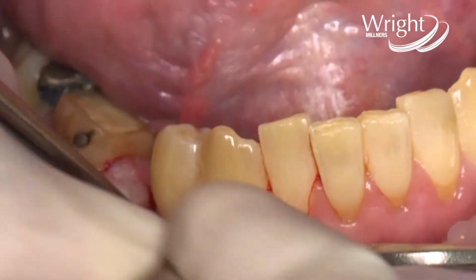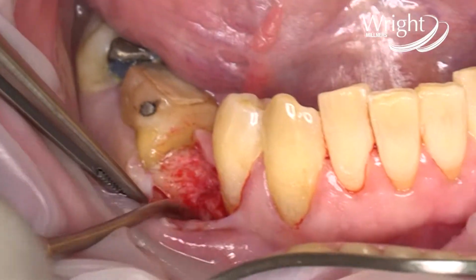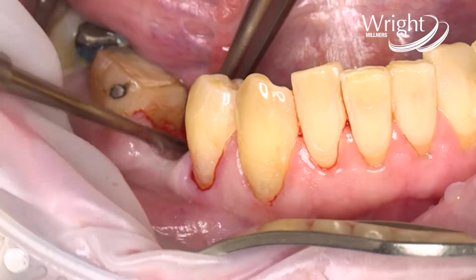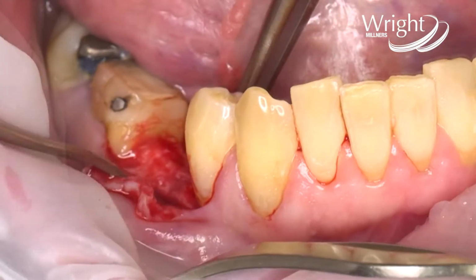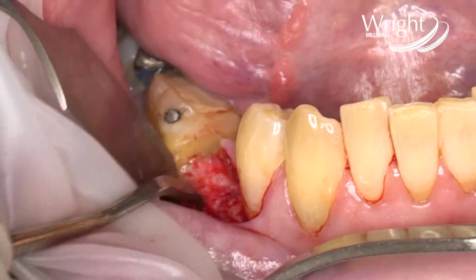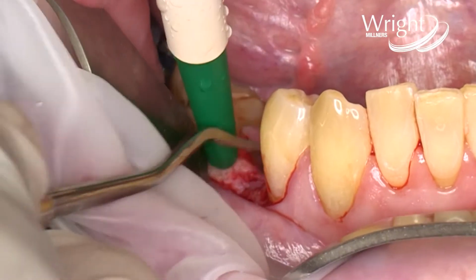We reflect so that we can see the buccal shelf of the ridge, and then we reflect till we see the lingual. Good visibility is of critical importance. Once we've done that, I take a Bozer bone scraper and I usually just clean the soft tissue tags off the crestal tissue just to give me better visibility of the ridge.